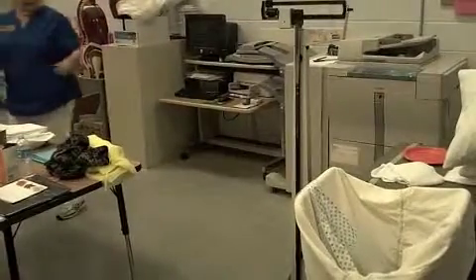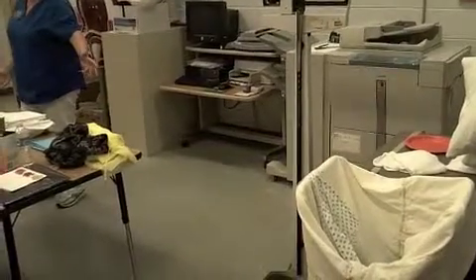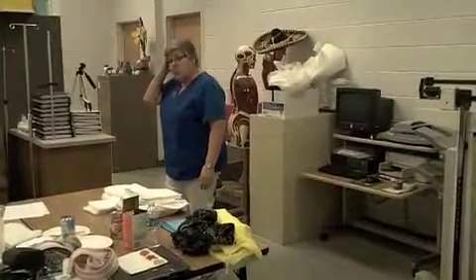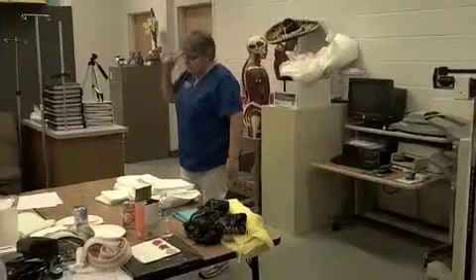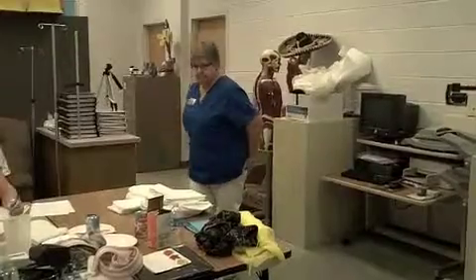Well, actually, because some people will step on the back of the scale just because they're a little bit clumsy or nervous or have lack of balance or whatever. But please tell them not to take that step for granted, because I have had a couple that failed with me because the people were on the very back of that scale and stayed there the entire time, and it was going flop, flop, flop. You know how it does? Flop, flop, flop, and it was like chasing rabbits up there at the top, and it was just terrible. But those 3 and 4, if they miss 3, they will miss 4. That's what the National Council has told us to do.